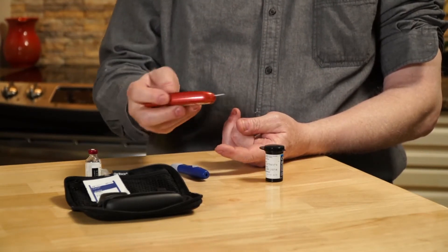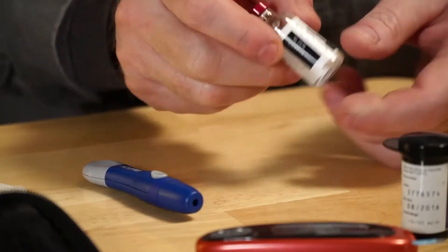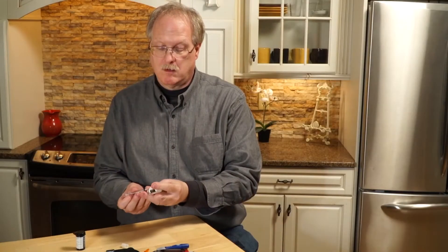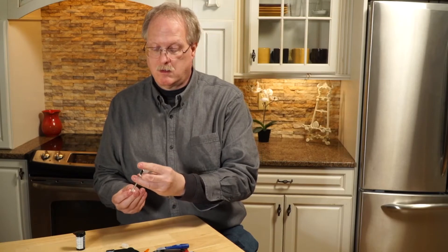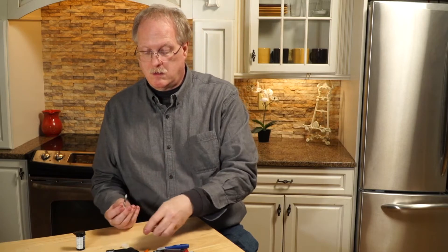Normally the patient, after taking the glucose reading, will take an injection of insulin. In this case we show a standard needle plus injector. We are using Lispro insulin, otherwise known as Umalog, from Eli Lilly Company.